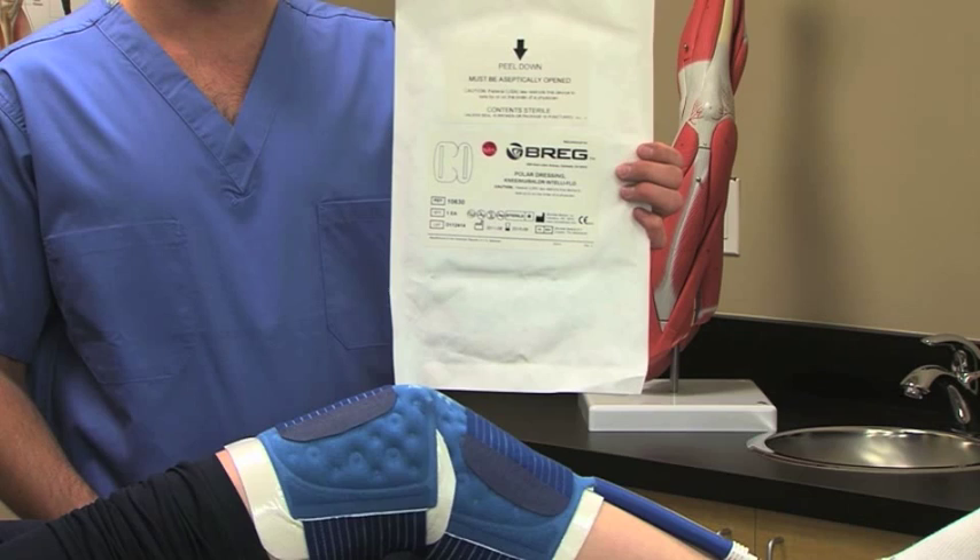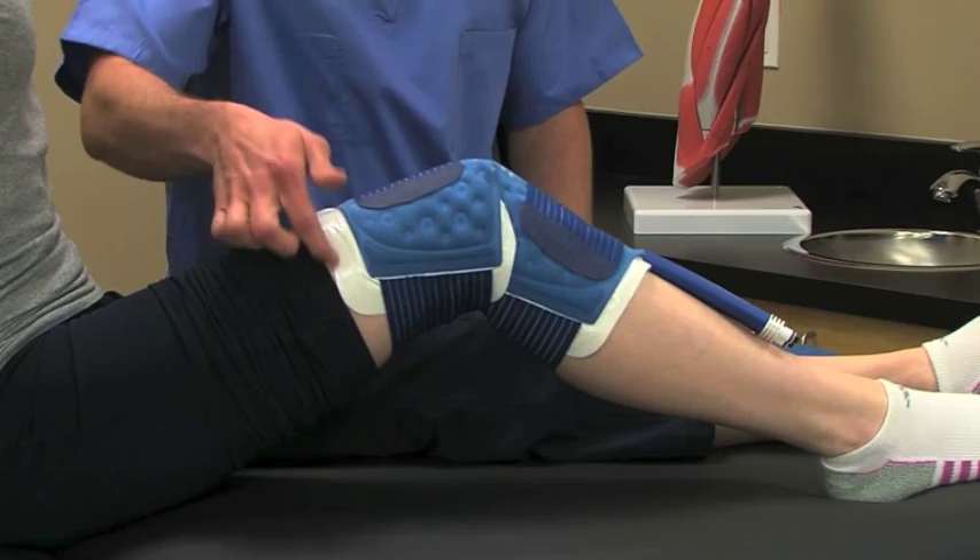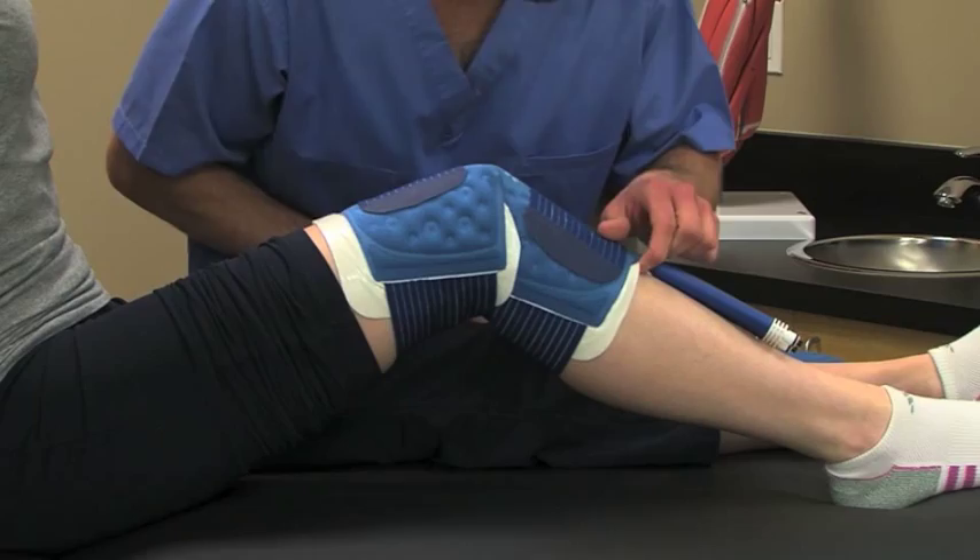To apply the pad, always use an insulation barrier between the pad and the skin, like a Breg Polar dressing, Webril, Curlix, cast padding, or an elastic bandage. Don't let any part of the pad touch the skin directly.